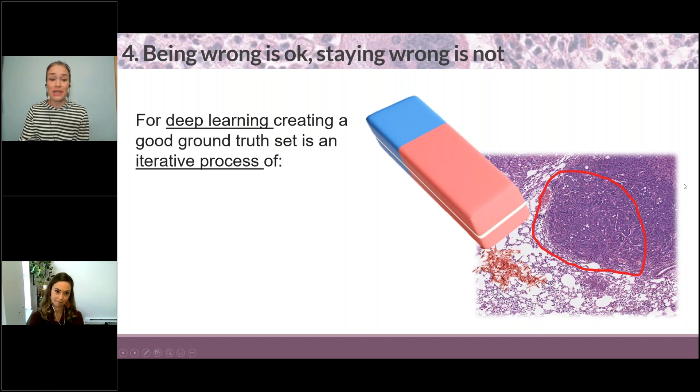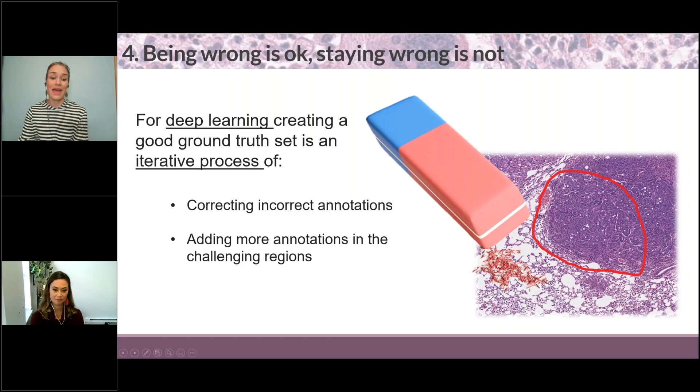So for deep learning, creating a good ground truth set is an iterative process like we've seen in what Lindsay just showed. And this iterative process consists of correcting incorrect annotations and adding more annotations in the challenging regions. This is an iterative process and you basically communicate with the model.